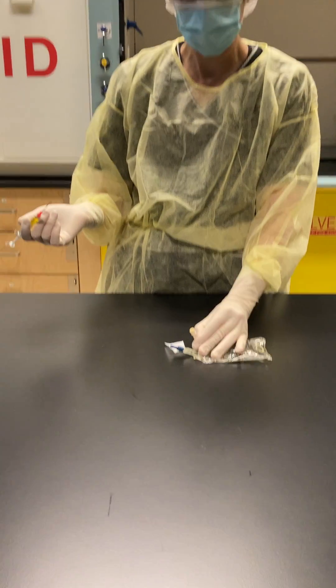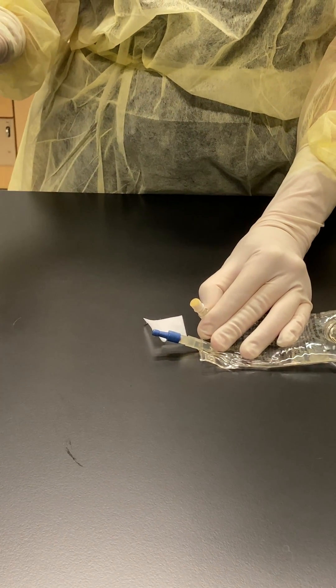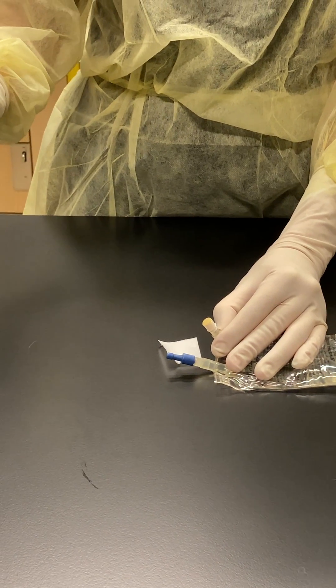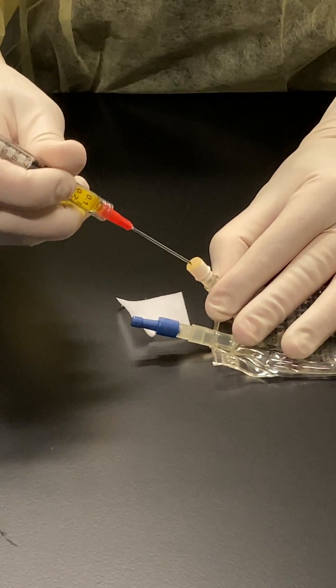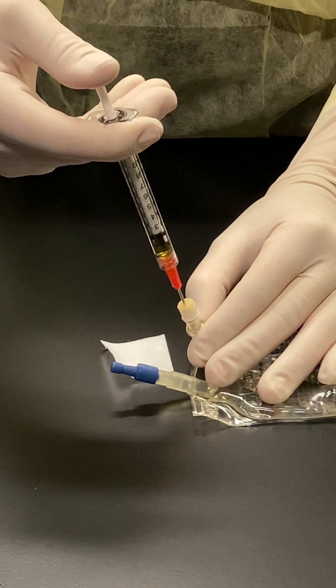With the port of my dextrose bag facing towards the air — coming down, the unidirectional air — as this is also considered first air, and then just push in my medication.